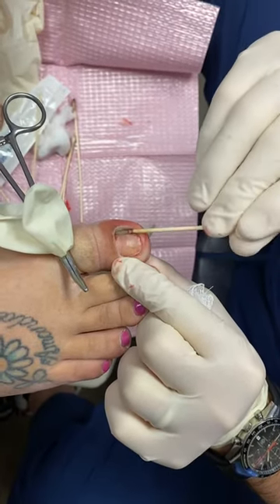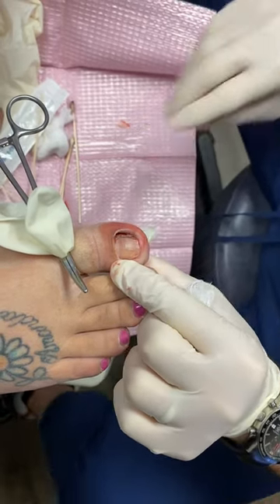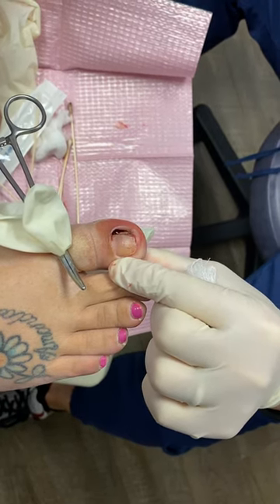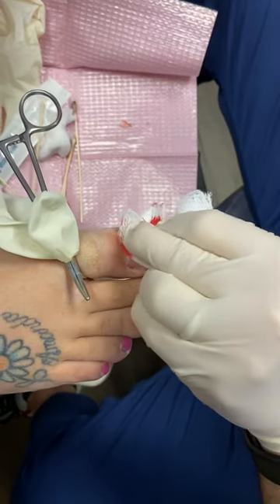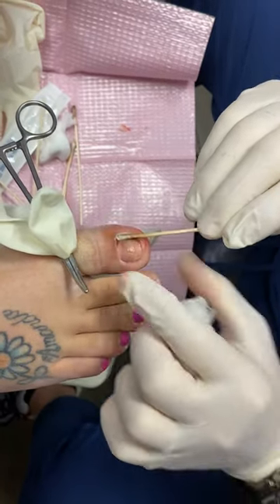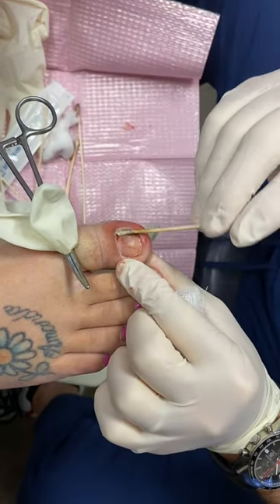We're twisting this in here and getting rid of this nail. Statistically, these have a very high success rate. The textbooks will say that about 10% of these will grow back, and we definitely have some patients where they do grow back — it just is the nature of the beast. Some patients' bodies just don't respond to the acid, and if that occurs, we'll do another procedure where I'll actually surgically cut it out.